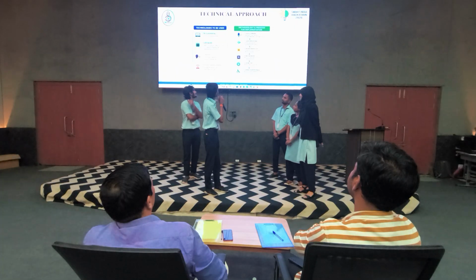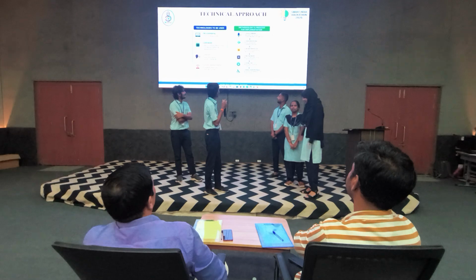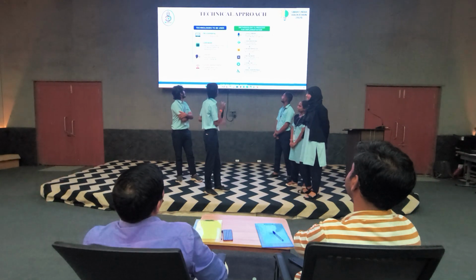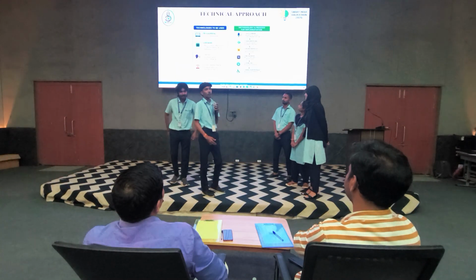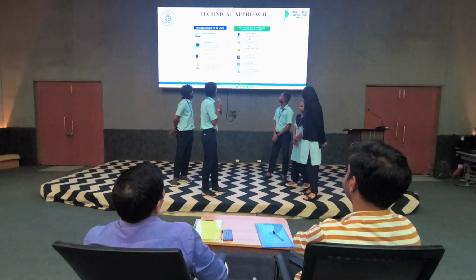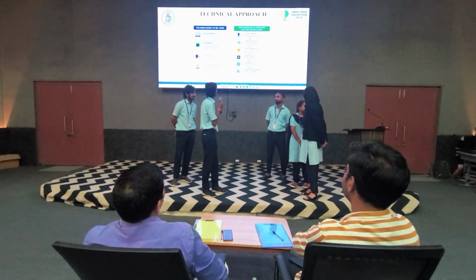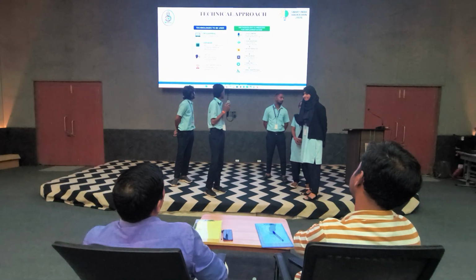Here are the basic technical approaches of our smart electric wheelchair. I will explain mainly about the technologies to be used in our smart electric wheelchair: the programming, hardware, control, and future enhancement. In the programming, we are using C and C++ with the Arduino IDE. The main hardware are the microcontroller, motor driver, DC motors, and some batteries.